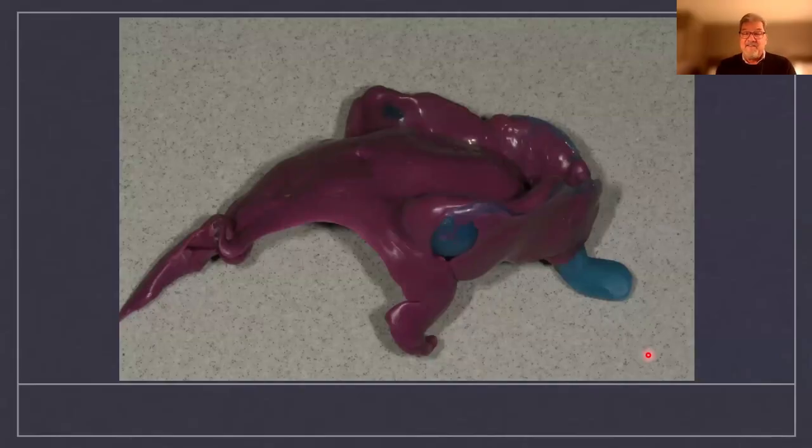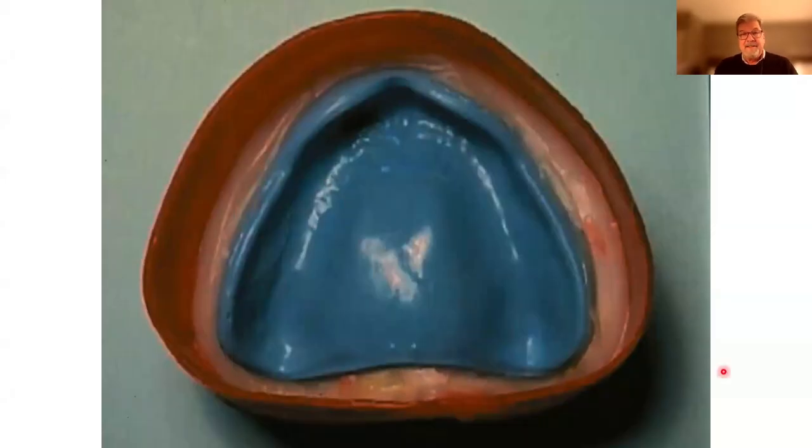When I got this, I felt so bad for the patient. I actually called the doctor and said, Doctor, can I make a new custom tray for you? No charge. I just wanted you to get it right this time and maybe have that patient sit up in an upright position and border mold it before we take the impression. And this is a great impression right here. We captured all the anatomical landmarks. It's beaded and boxed and ready to be poured.